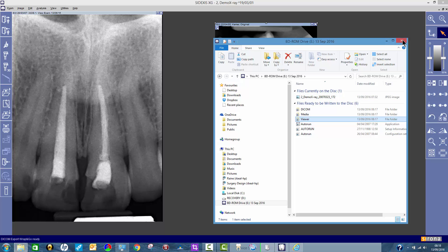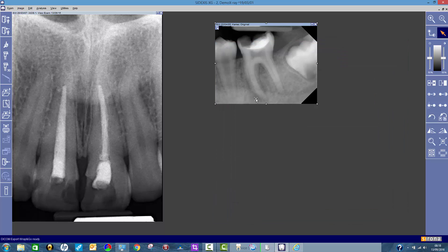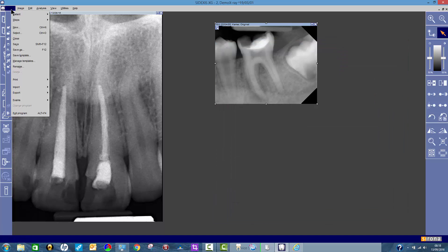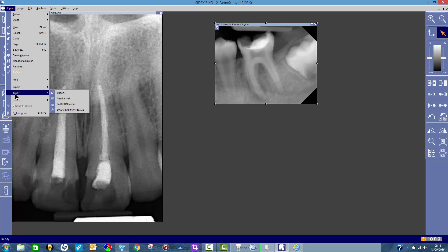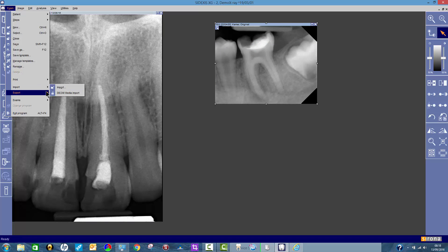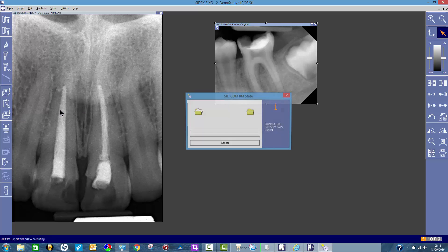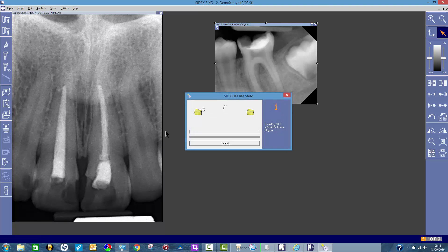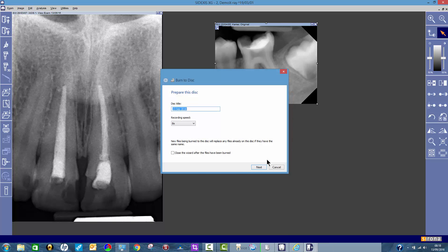So easy as that. Just to recap: there's your two images. You just click on exam, export because you want to export them onto a disc. Then DICOM export wrap and go. If you click there, it just talks you through what to do next. And you click next.